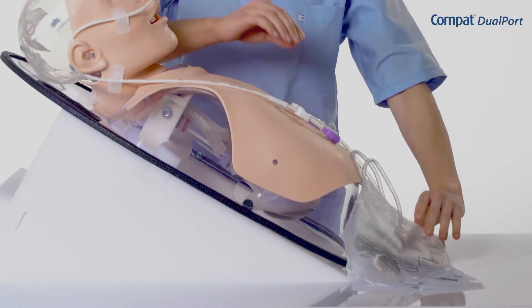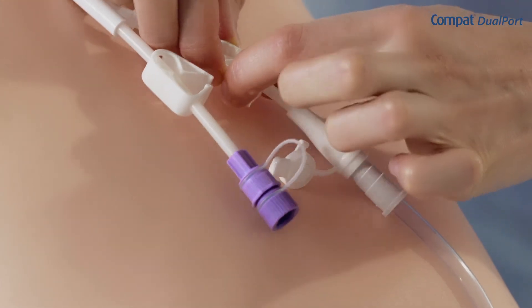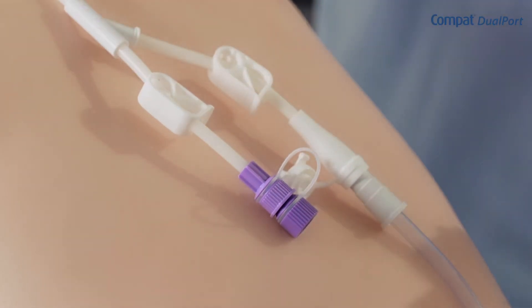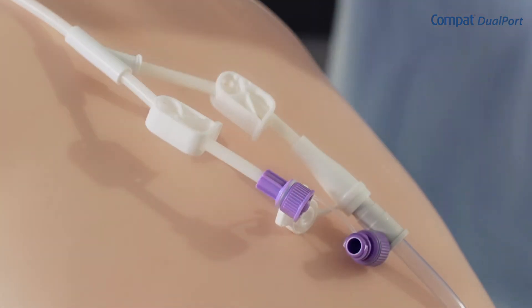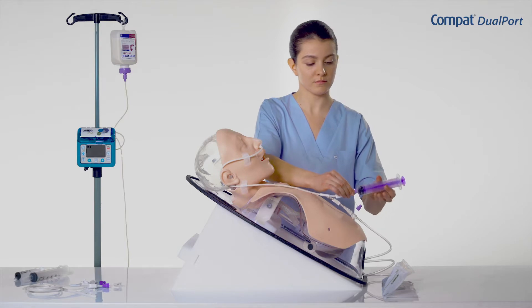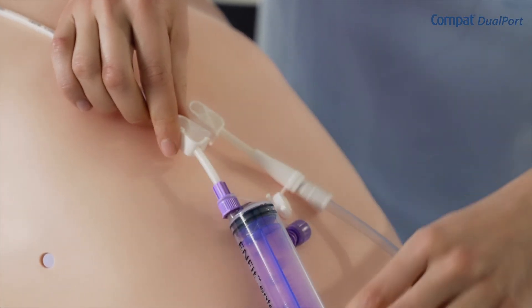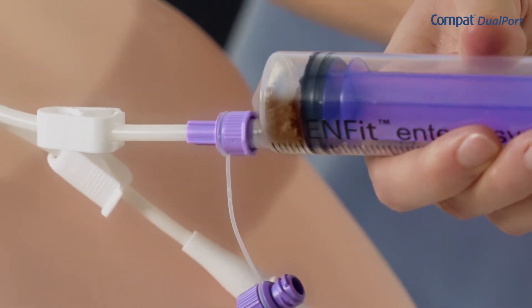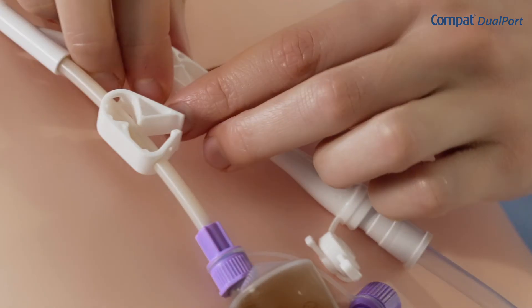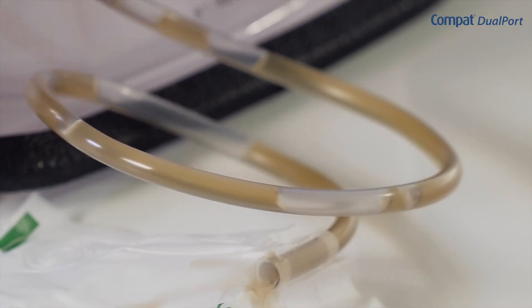If the gastric residuals do not begin to flow into the bag, drainage should be initiated using a syringe. To do this, close the two clamps. Open the cap of the Enfit port and connect the syringe. Open the clamp on the enteral feeding lumen and start to aspirate the gastric residuals. Then open the clamp on the drainage tube and make sure that the gastric residuals are flowing into the bag.